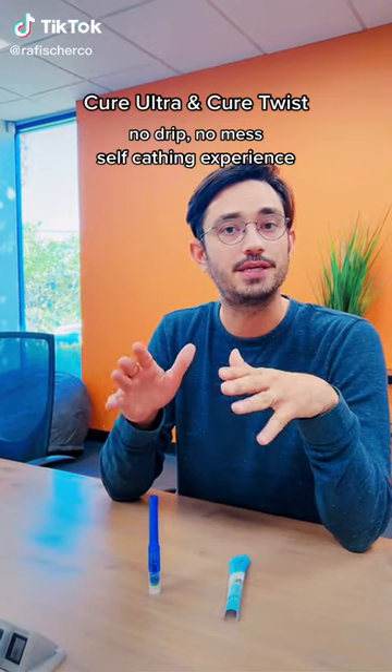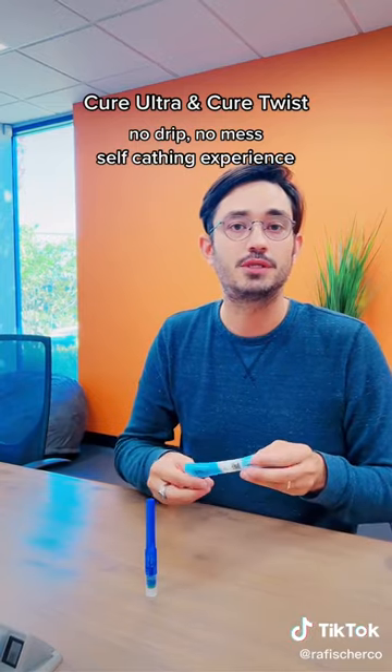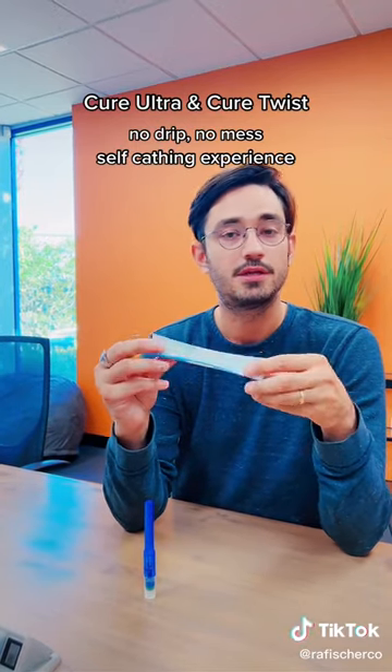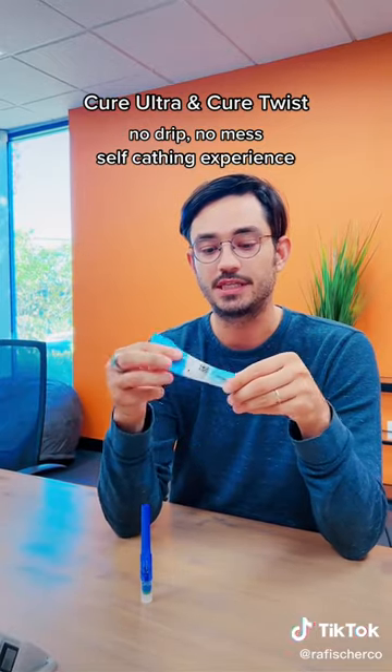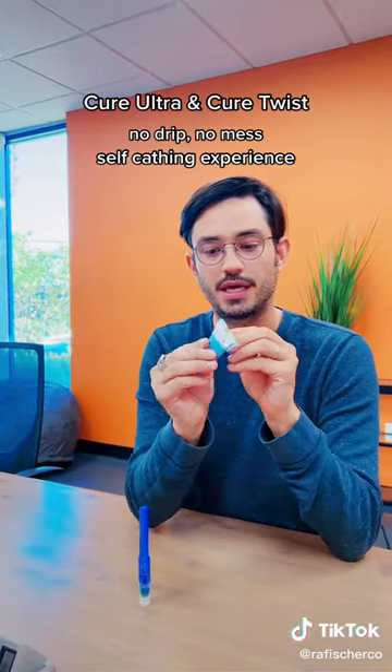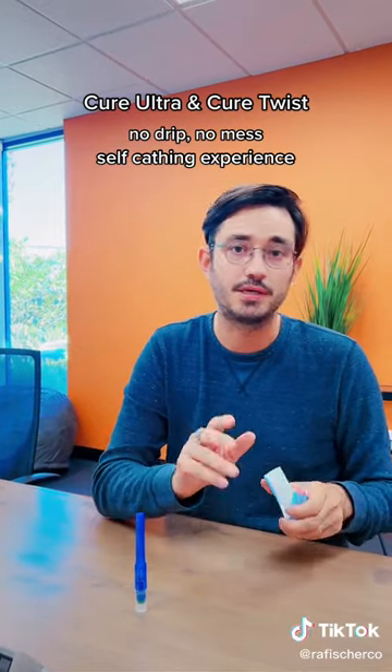Let's take a look at two types of female intermittent catheters for patients who are self-cathing. First up is our Cure Ultra catheter. This is a pre-lubricated catheter. What I like about the design is that it has a no-kink design, so you can bend this, fold it, put it in your purse or pocket. It's really portable.